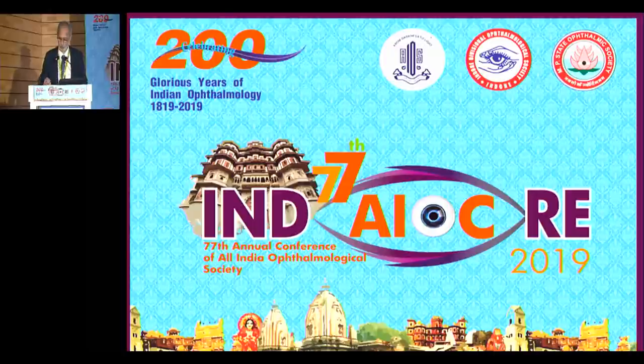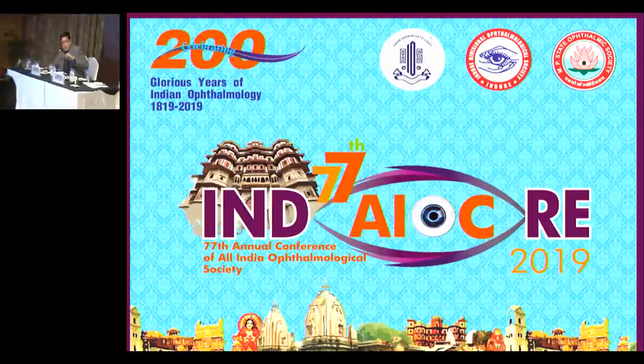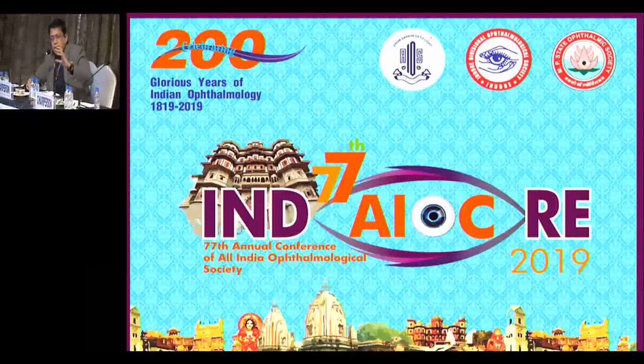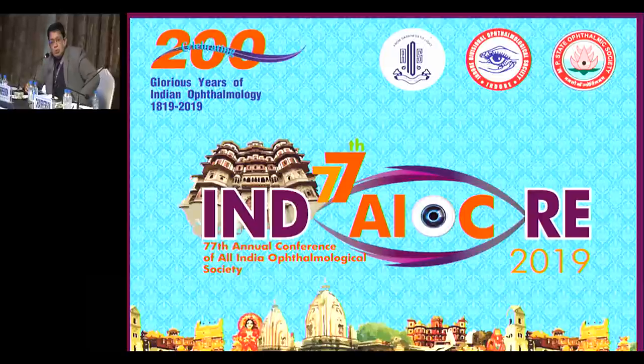I think Dr. Suhas very comprehensively covered the topic. And he not only covered the lens, but he dwelt upon various aspects that need to be taken into consideration. And the good news is that you don't really have to worry your head about all those compensations, that toricity ratio, etc., where depending upon the base power of the lens, the power of the toricity also changes. And as he mentioned, Barrett toric calculator seems to be the best way to go.